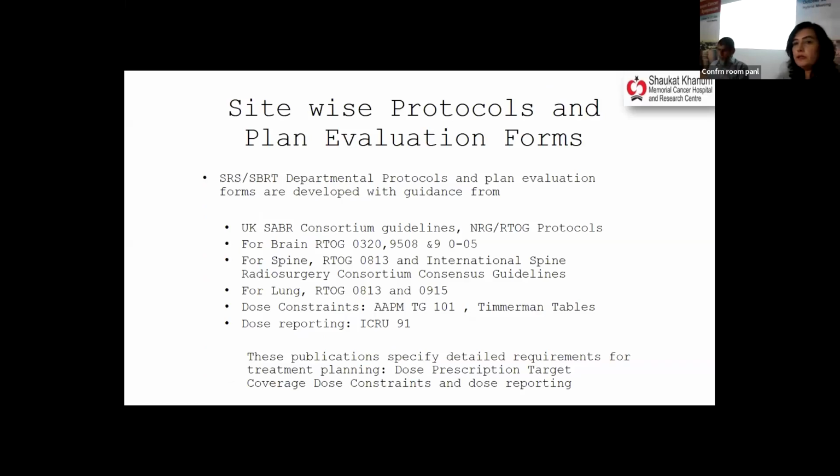One of the things we are really careful of, before we start any new SBRT site, is to ensure that we have site-wise protocols and evaluation forms, because we are a very busy center. On our SRS-specific machine, we treat about 50 patients, and before we treat those patients, we have about 2 to 3 SBRT cases on a good day. So we have developed these with a bunch of our team and a few of our consultant physicians involved.